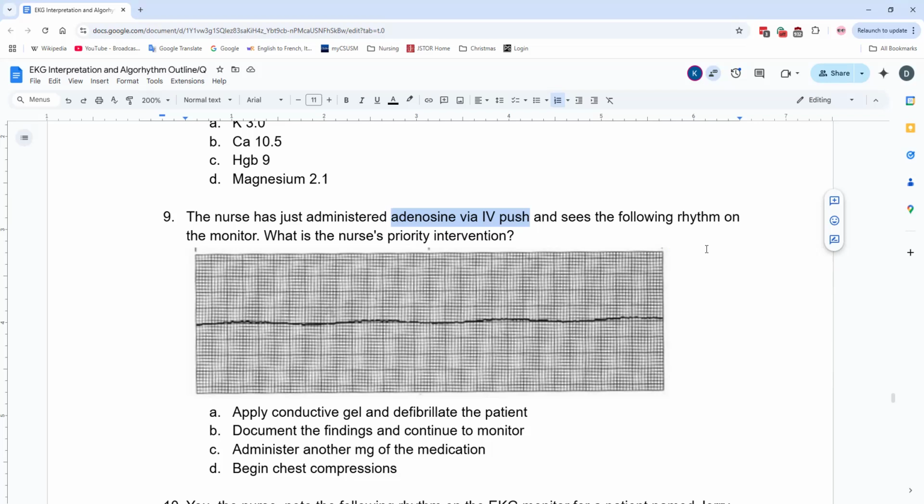In the instance that I saw, it only lasted about 5 seconds. It was very quick. But I guess this is going to depend on individual reaction. I don't have as much experience with seeing it, as I had only seen it one time. It seems like it typically is less than 5 seconds, but I guess it depends on the person.